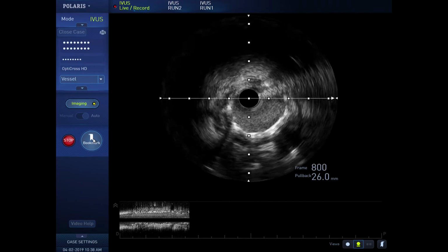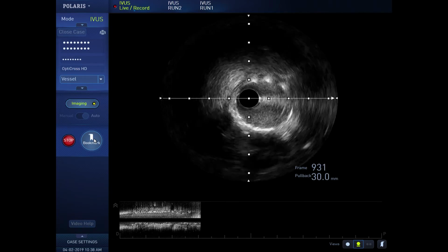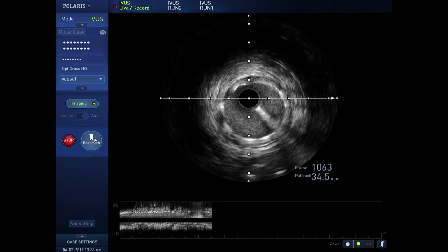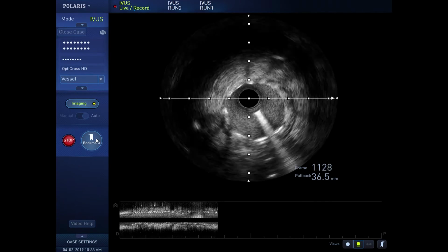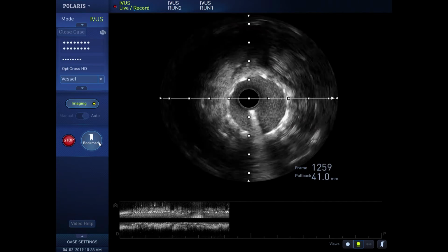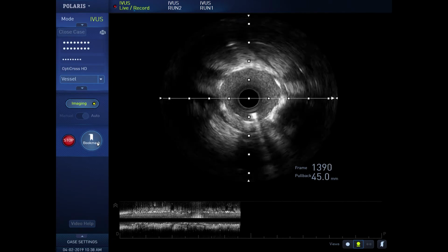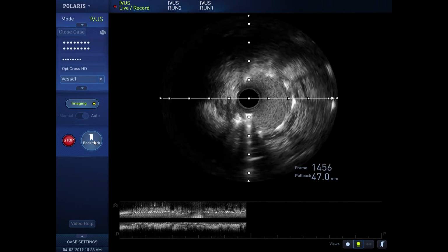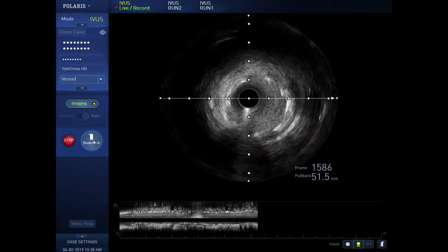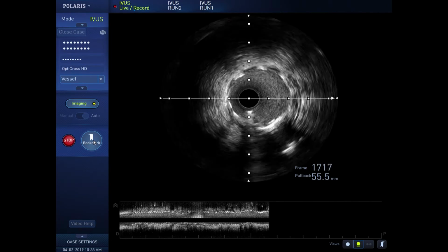Let me see if it's well-expanded all the way through. All the way. It's at least nicely expanded, though I don't know, you could go a little bit more, I think. So what we actually did was, in the middle, the 2 lesions already covered with perfect circularity. Now we have one more final lesion in the more proximal. So far, perfect circularity, which has been a predictor of great outcome if the stent is round versus elliptical. And this is round all the way.